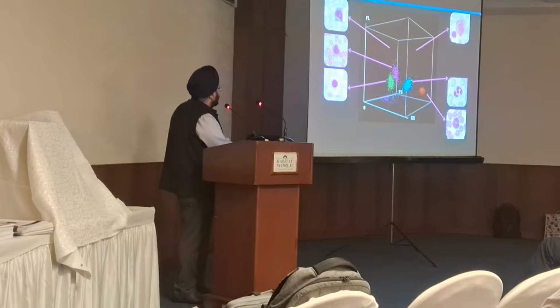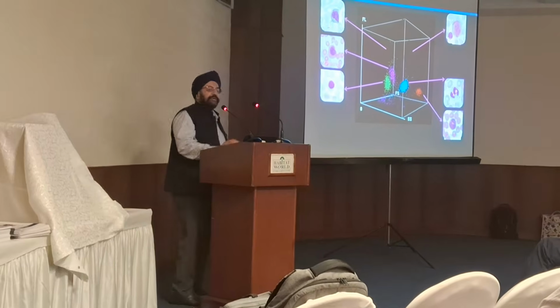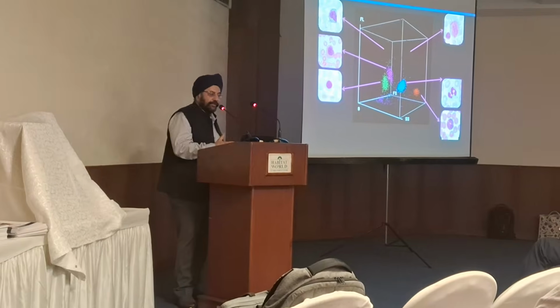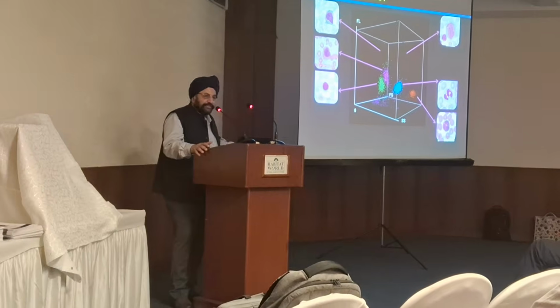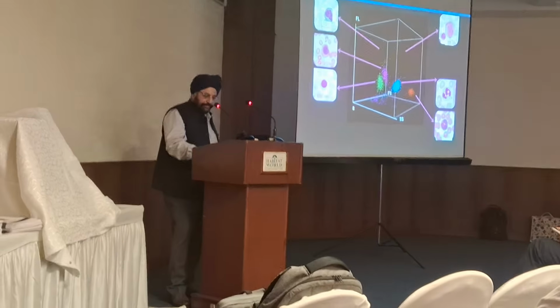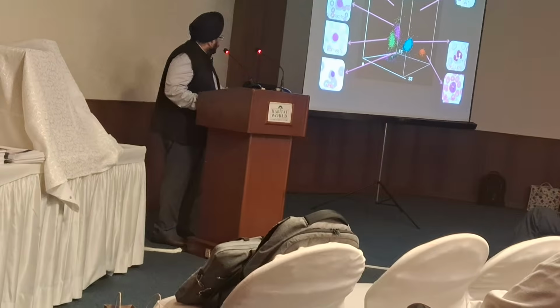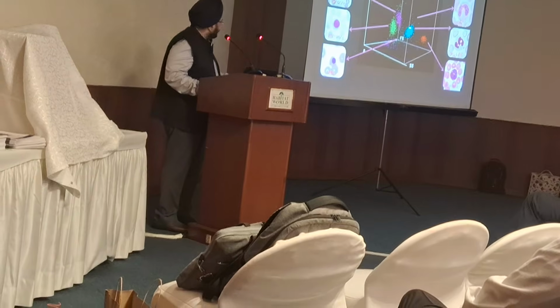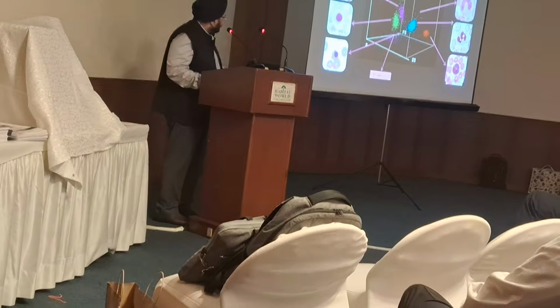This area above the neutrophil is the area of the immature granulocyte. This is nothing but your myelocyte, metamyelocyte and promyelocyte clubbed into one. They have a numerical value, they have a biological reference interval. So the higher the immature granulocytes, the more the shift to the left. This small area below is the area of the nucleated RBCs. These are the band forms, which are placed between the neutrophils and the immature granulocytes.